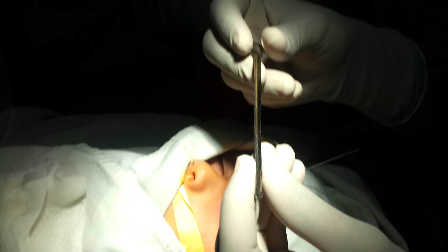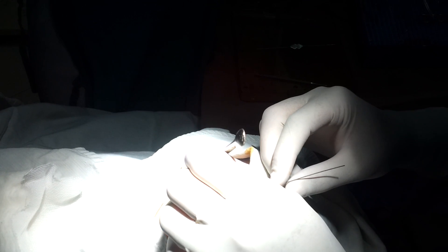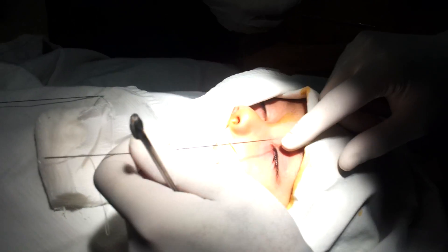This is the instrument that we will use to retrieve our wire from the nose to guide our silicone tube inside. This is our silicone tube and this is the guiding wire. The silicone tube is used exactly like the probe.